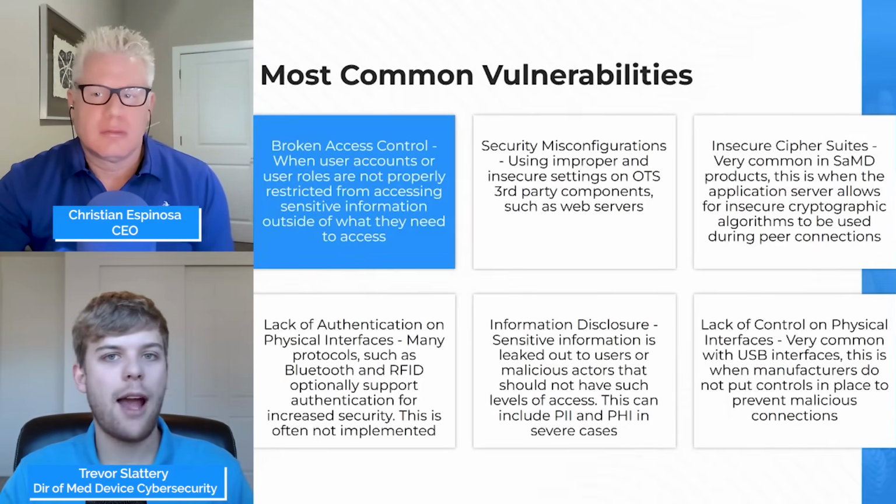So this is a best practice to implement. Make sure that Bluetooth authentication is enabled, RFID authentication is enabled, and in general, that authentication is enabled wherever it is possible.